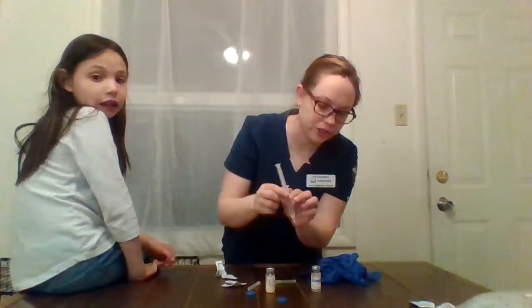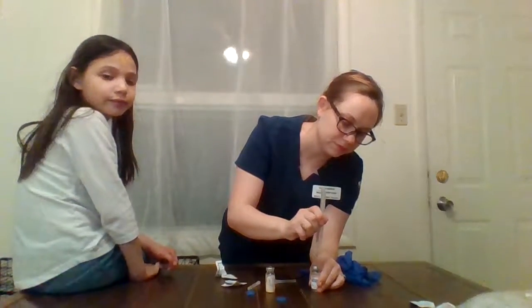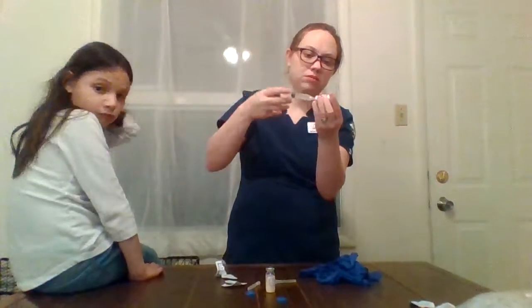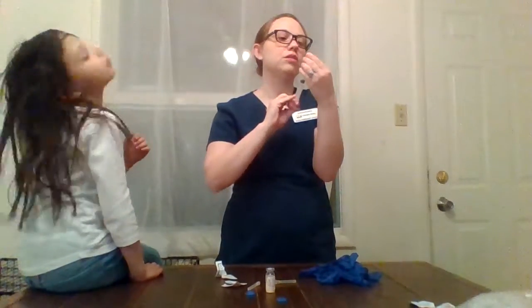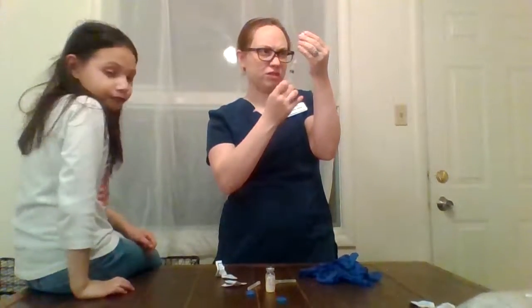Oops. I'm going to inject that air into the diluent vial. I'm going to draw up the amount of diluent that I need.